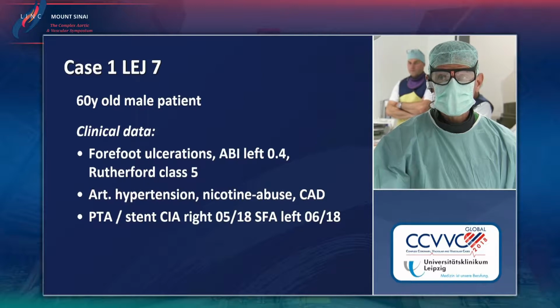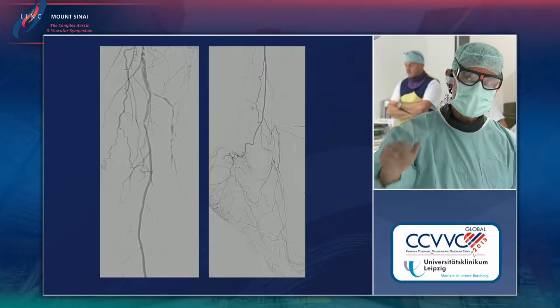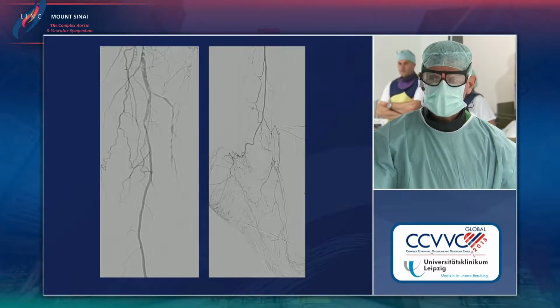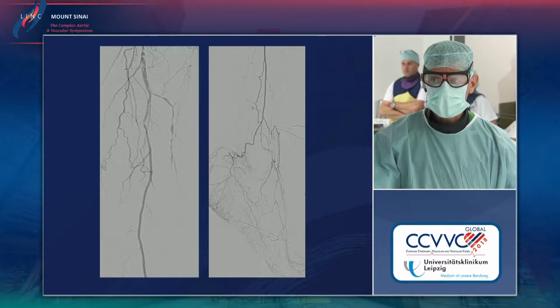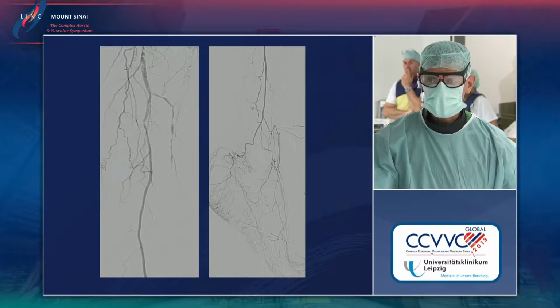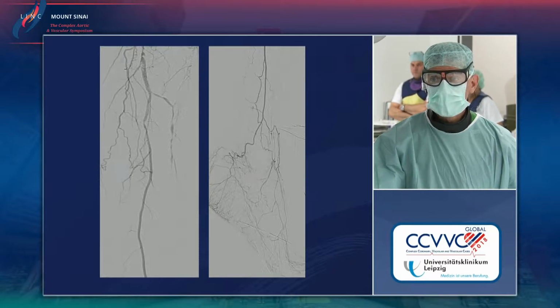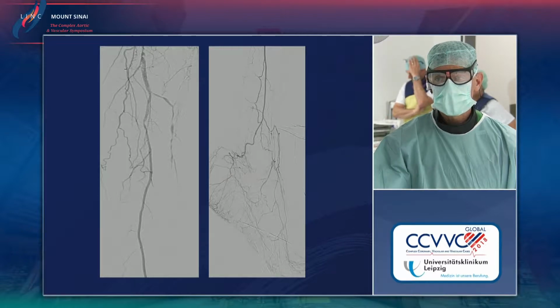Next slide, please. Here is the below the knee situation. You also see some popliteal stenosis, which we have treated recently. You see the peroneal artery going down, foot arteries very small. We think the dorsalis pedis artery is a good target, filling the forefoot arteries better than the plantar branch, which also may be difficult to reach. It also appears here already, I mean, the angio looks like calcium, although this is not a fluoro image.